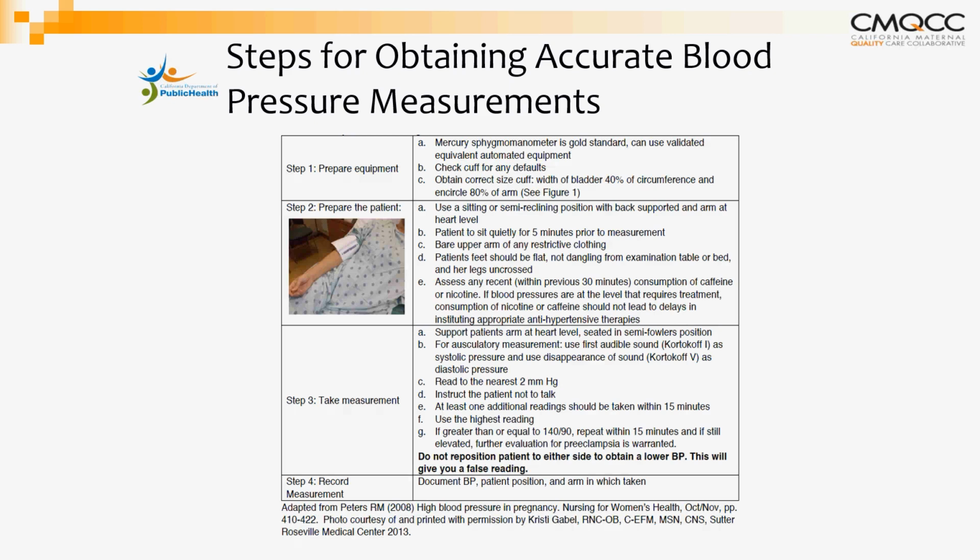So this just provides a basic overview. This was adapted from a journal back in 2008, but nothing really changes with regards to how we take blood pressure. It's really important that we have the correct equipment, right-sized cuffs, and that we don't allow the patient to, we know what it's like when the patient comes in, or she's been rushed, or she's just woken up from sleep.